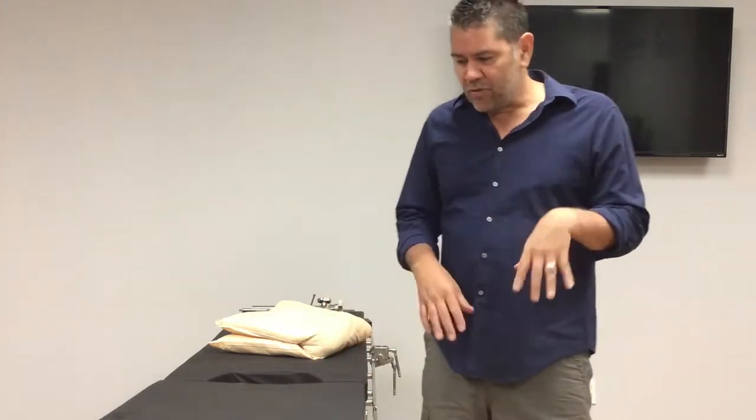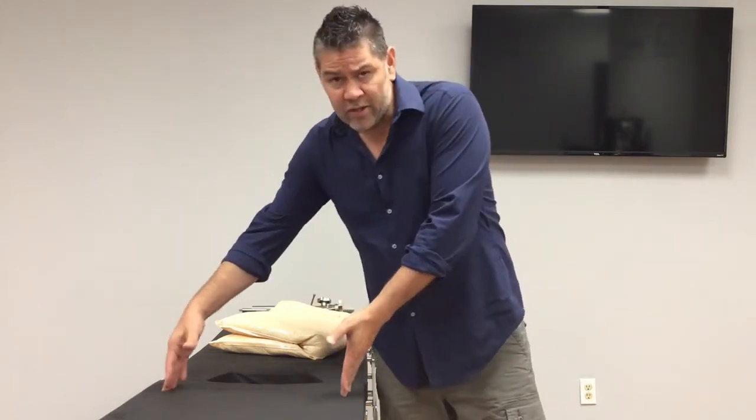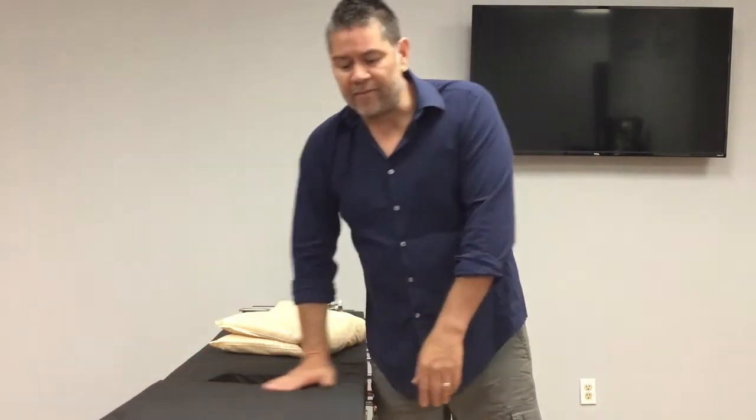This is a general surgical table. As you know, all surgical tables are pretty much designed the same. They all have a fixed rail structure where we apply accessories like fixed post retractors, stirrups, arm boards, things like that. Surgical tables are also only 20 to 21 inches wide. From rail to rail, this is about 22 to 23 inches wide.